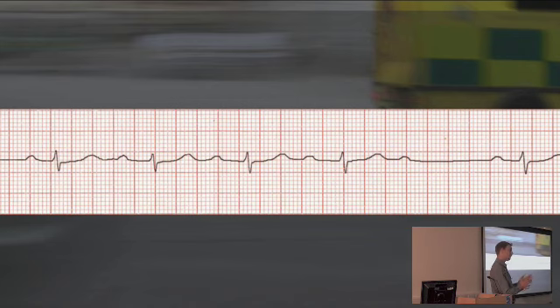So then we've got to differentiate between the two types of second degree heart block. Is it type 1, as in Wenckebach? Or is it type 2, Mobitz type 2 heart block, in which case there's a fixed PR interval, but some beats are dropped. In Wenckebach, the PR interval gradually lengthens until eventually you miss a beat and then you start again. So that's second degree heart block, Mobitz type 1 or Wenckebach.